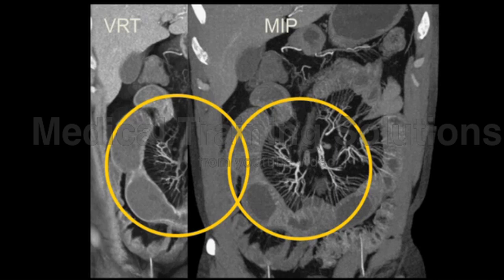What you see very nicely with a neutral contrast agent, and this case shows it very well, is the interface between bowel and the vessels, the vasa recta, also the enhancement of the bowel, which is a white bowel in this case, which means the patient has active Crohn's disease. So just a very nice example. Now let's take it a step forward. The ideal contrast agent not only opacifies the bowel with a neutral agent, but brings fluid in the bowel to distend it a bit more, and that's really what you're trying to do with CT enterography with Volumen.